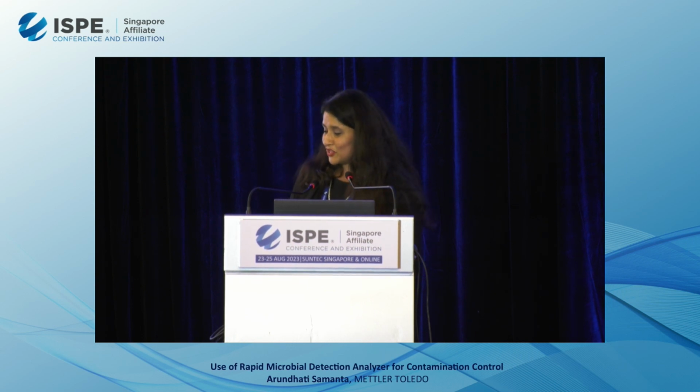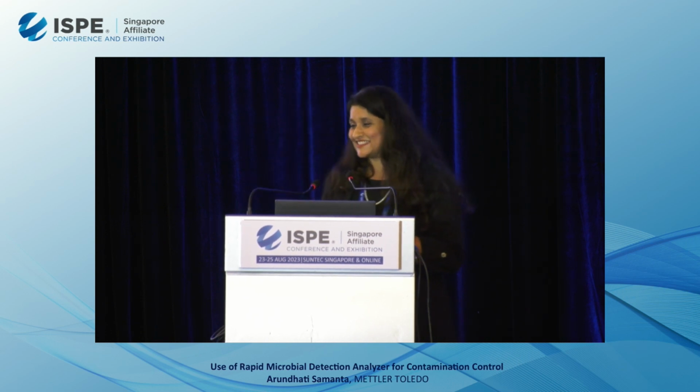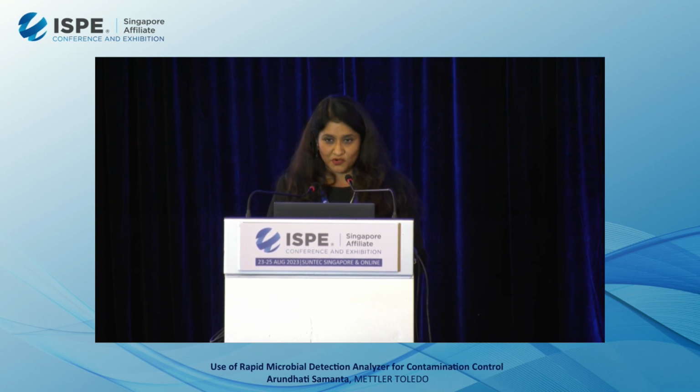Yep. Thank you for the question. I have got this question every time I have presented, yes. It depends. For WFI quality water, we cannot really tell you what your baseline AFU will be. It could be high. We have seen WFI which is as high as 1,000 or 2,000 AFU. Again, remember, when you see 1,000 or 2,000 AFU, that doesn't always convert to your CFUs because not all of them grow, right?